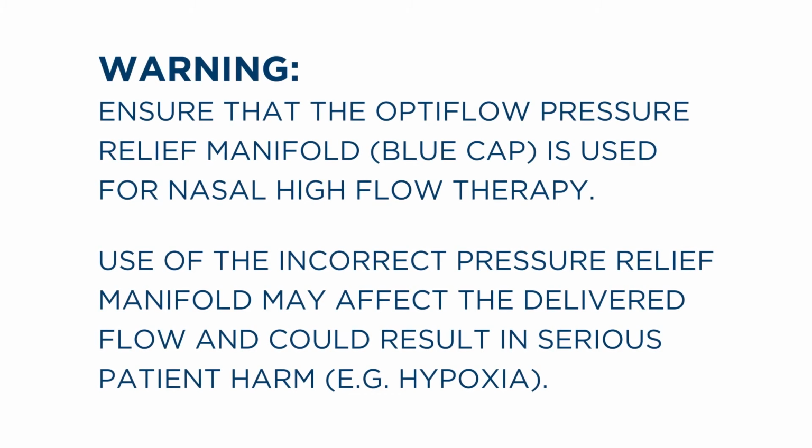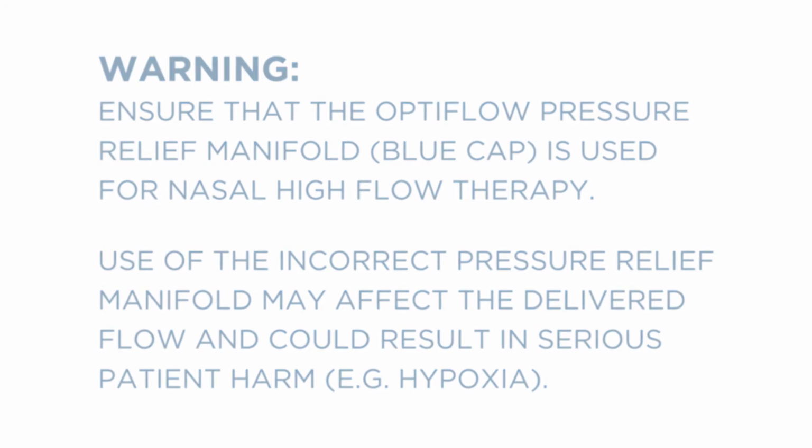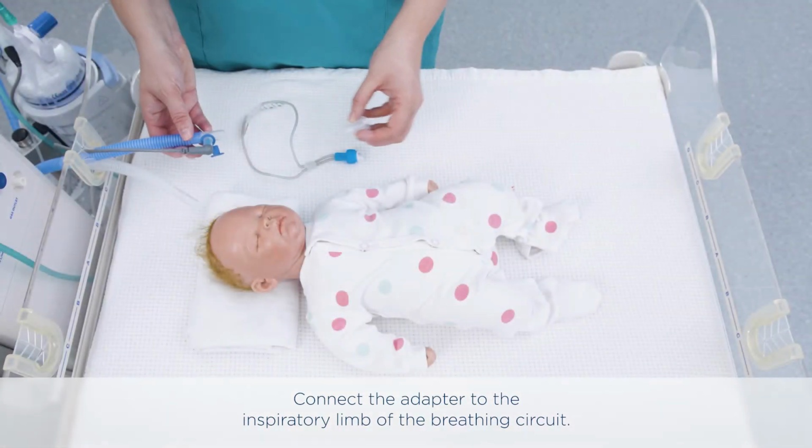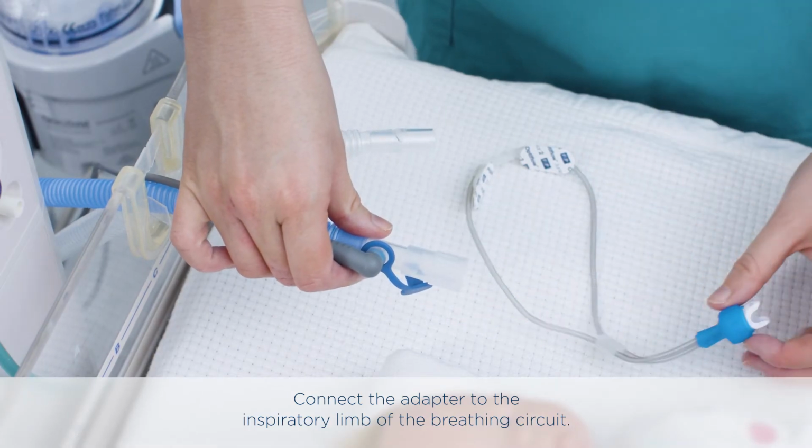Warning: ensure that the Optiflow pressure relief manifold with the blue cap is used for nasal high-flow therapy. Use of the incorrect pressure relief manifold may affect the delivered flow and could result in serious patient harm, for example, hypoxia. Connect cannula. Connect the adapter to the inspiratory limb of the breathing circuit.